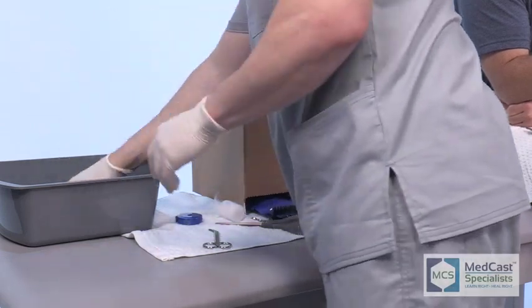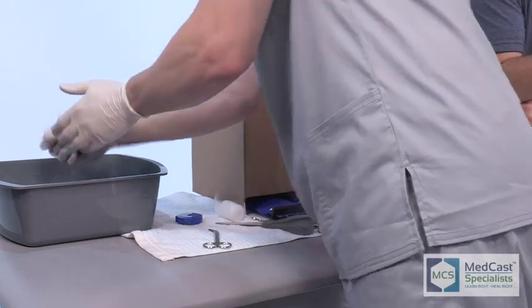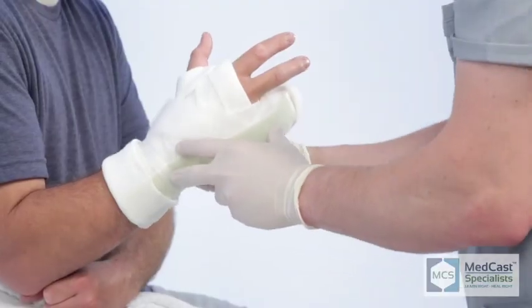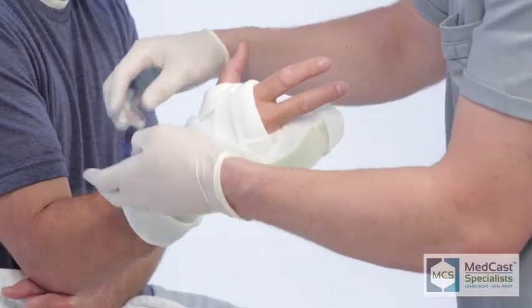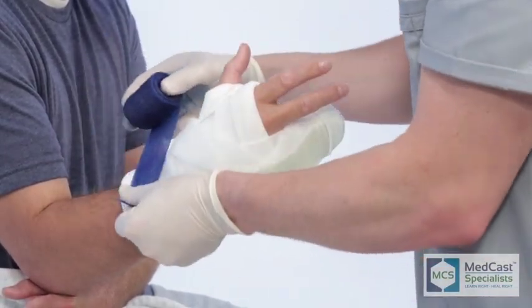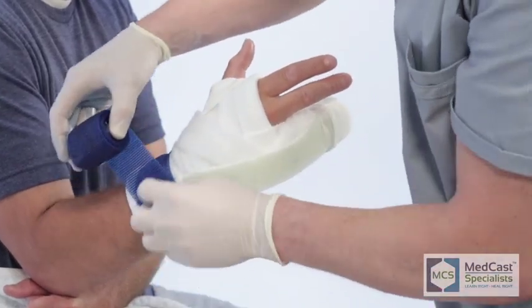We like two-inch cast material and you can usually get away with one roll. If you have any doubts, go back and reinforce a little bit with another roll. But using two-inch allows it to be a sleeker, lower-profile cast that still doesn't inhibit functionality. It's still going to do its job — it's strong and it's going to hold them in the correct position.